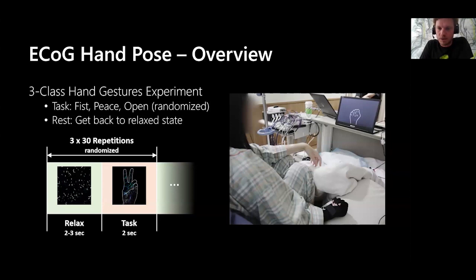This was a two-stage procedure where she had electrodes implanted in the first surgery, and then she stayed 2 weeks in the hospital, where lots of examinations took place to plan the final resective surgery, where parts of the brain were removed. And during these 2 weeks, we also were able to record some BCI experiments with her.